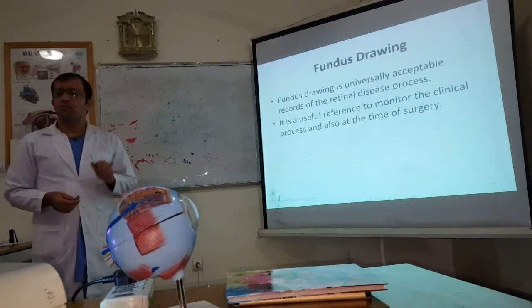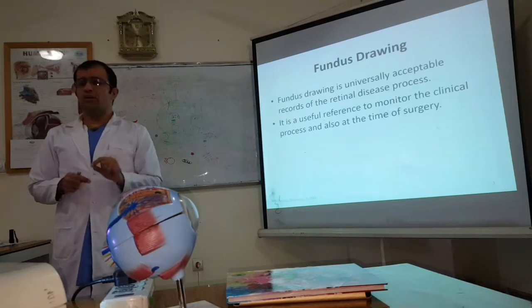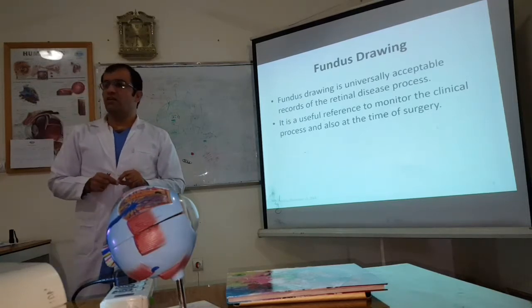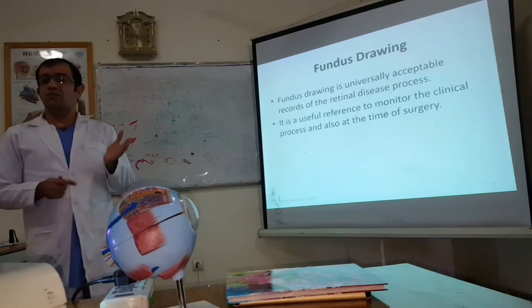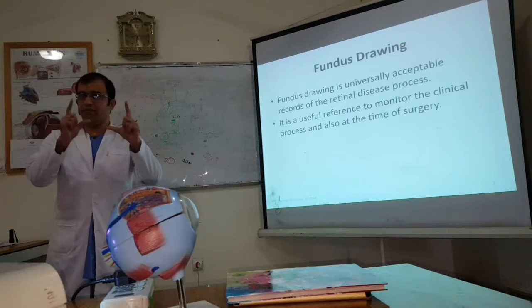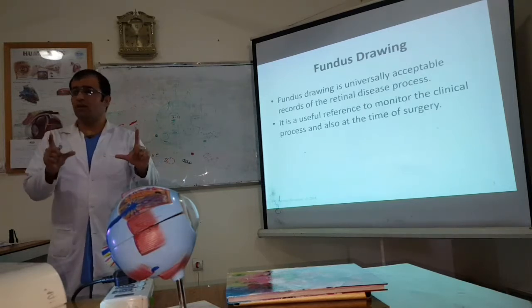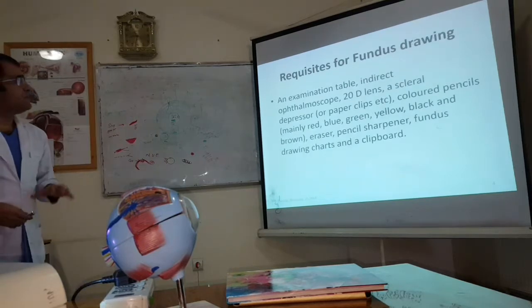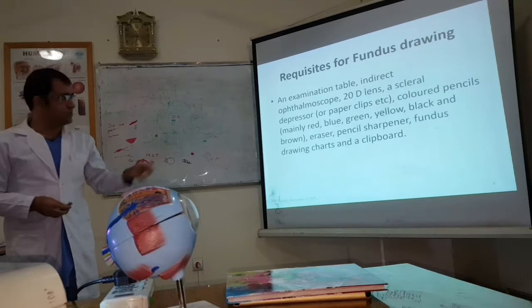And also at the time of surgery, if we have a drawing in front of us when we do retinal surgeries, then we will understand where the location of the lesion is, what the lesion is, and which procedure we should do. We have a visible picture of the lesion. And the things we need while doing fundus drawing, we will discuss them.